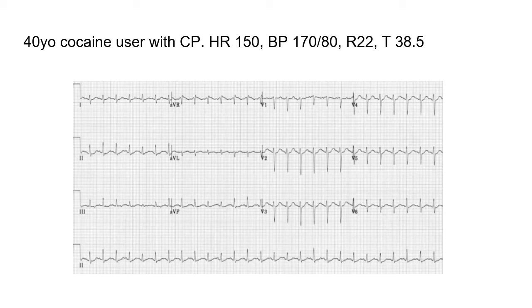What do we think? A narrow top, yes. So perfect. So it's narrow. So our QRS is narrow, and we're beating at 150. So we're at tachycardia. Are we regular or are we irregular? Regular. Okay. So our regular tachycardia is either SVT, A flutter, or sinus tach.